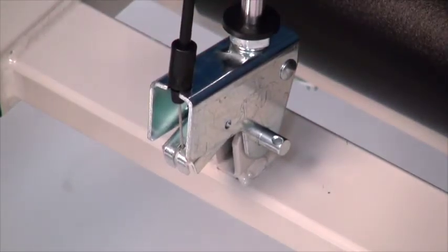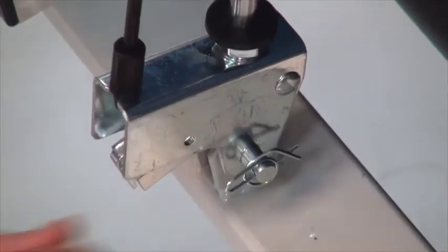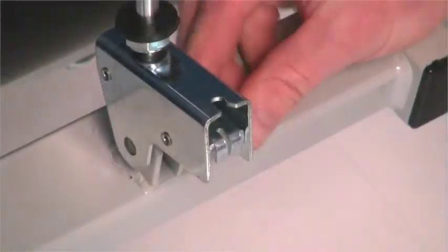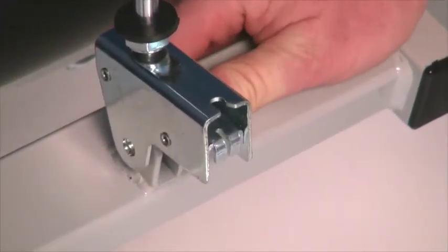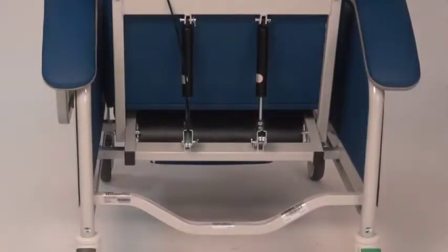Secure the clevis pin by placing the ring cotter pins through the hole in the clevis pin as shown. On the FR-587W recliner, repeat these steps with the second gas spring. Correctly installed back gas springs. Reinstall side panels.